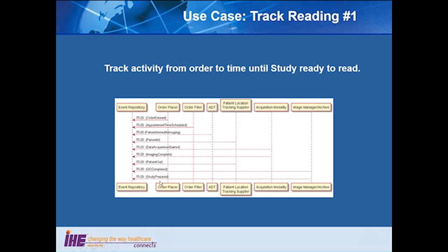And here is an example. These are all existing actors that could be upgraded to include SOL capability. It's certainly not restricted to these actors, but an order placer could report that an order was entered. The order filler could say when it was scheduled. The ADT system could track when the patient arrived.